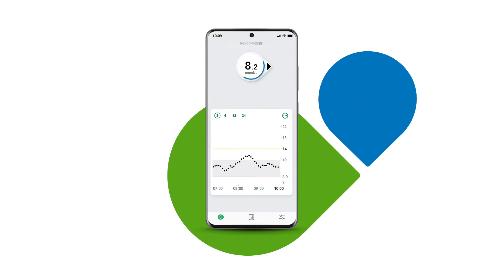Your glucose is always changing. This is why the trend arrow is important. It shows where your glucose is heading and how fast it's moving.